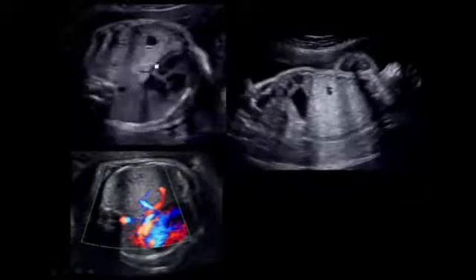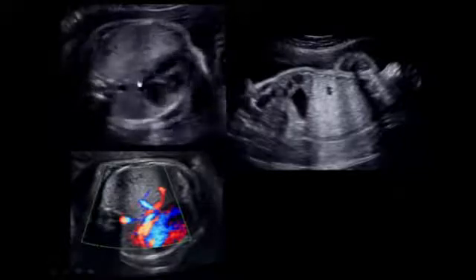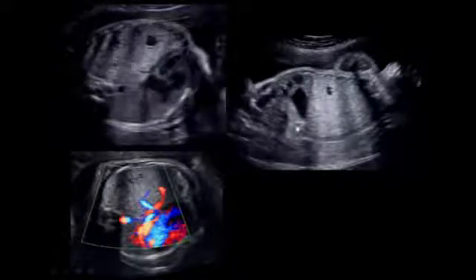Another patient, farther on, we see small cysts. The heart is not quite as displaced, though, in this instance. So this is a left-sided lesion with several small cysts. When we look at it sagittally, we can see that the diaphragm is intact, and also that the blood supply is coming from the lungs. It's a pulmonary blood supply, so we're confident we're looking at a CPAM.